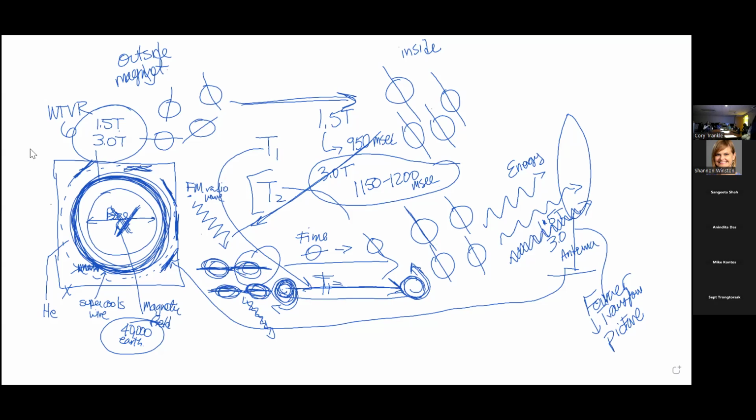Also, the magnet is in the room because we don't want things to get in there. Non-ionizing electromagnetic radiation. Channel 6 is right down the street. How coincident is that for you, fellows? You move to a place that you're perfectly suited to have your MRI scanner messed up, imaging. Okay, so you've got to keep the door shut. That's the big thing, right?